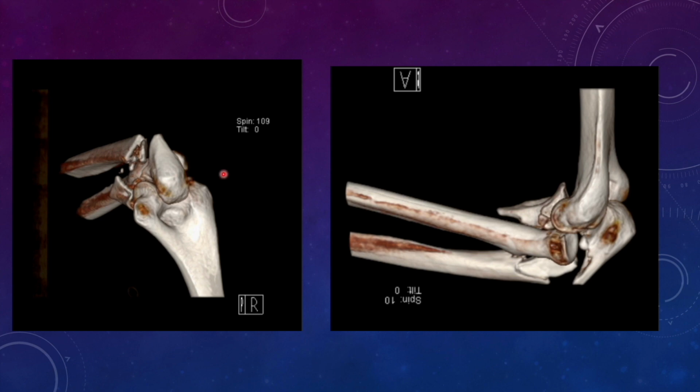So you see there is definitely a fracture of the olecranon, and the radial head is also fractured, but probably there is an impaction injury. We don't see a separate fragment here, only the shape of the radial head has been compressed. It has become flattened in the anterior part because of the impaction, and probably some injury to the capitulum also. This part appears to be flattened because of the impaction, and probably these injuries need nothing to be done from the fixation point of view.